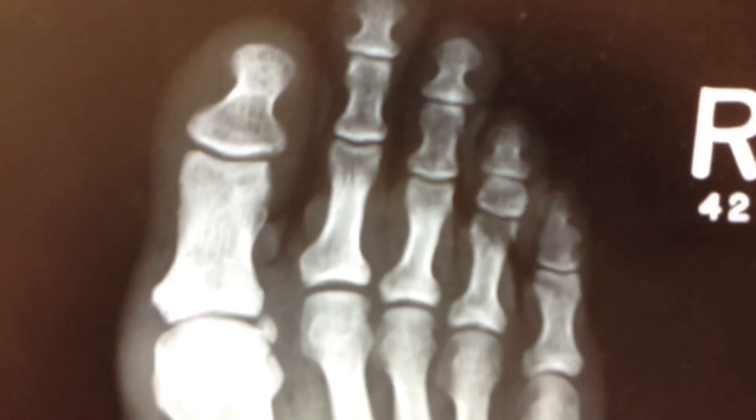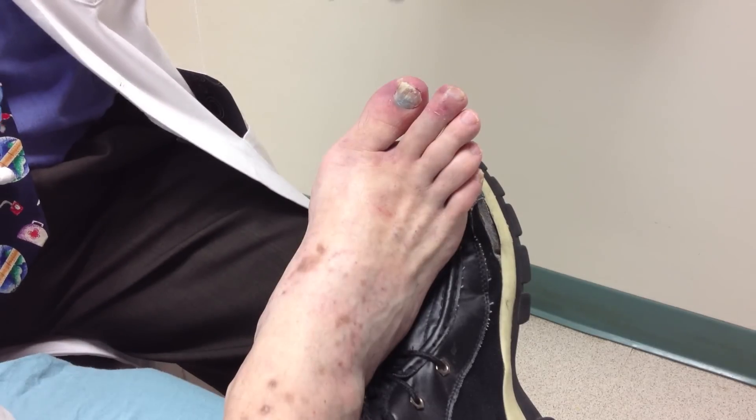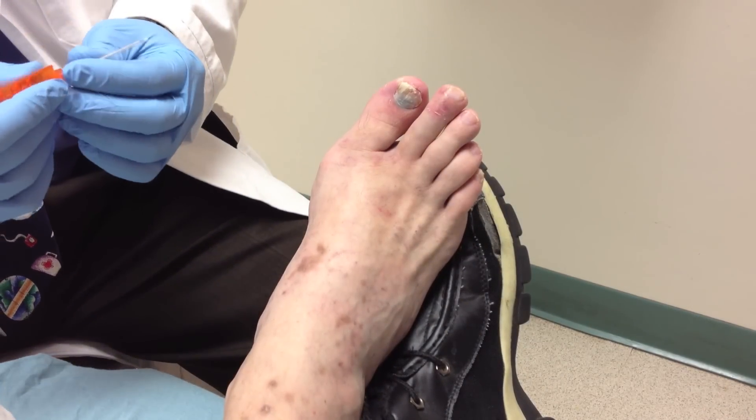We did an x-ray which I'm going to show you right now and it didn't show any fractures, so we know that if we open that up we're not opening a pathway for bacteria to get into a fracture segment or anything like that, so we're safe.